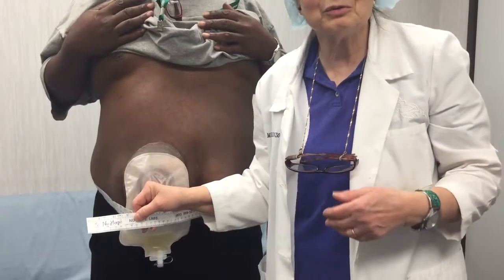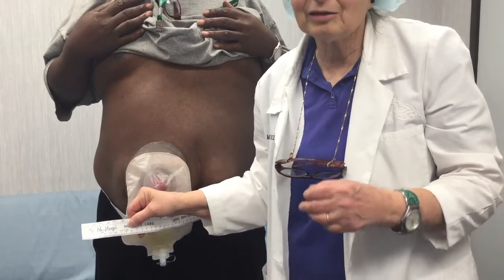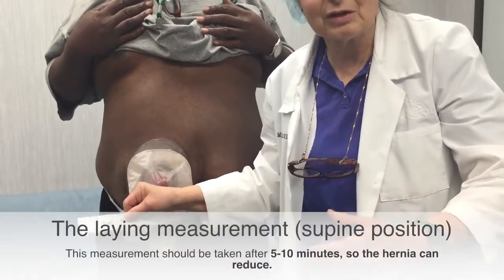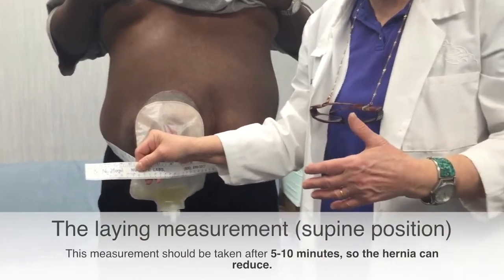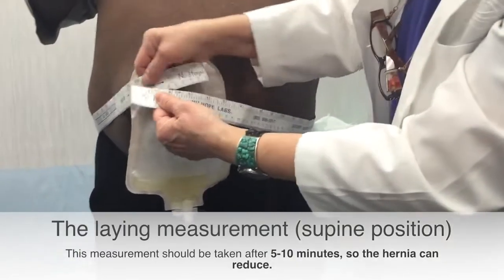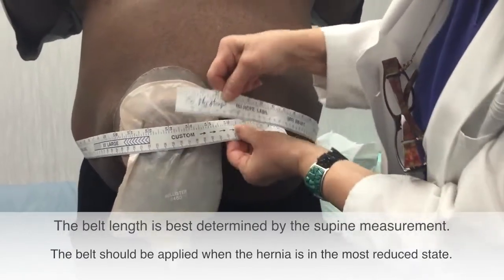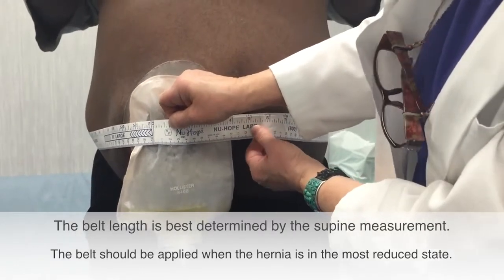So what we're going to do is determine the length of the belt that we need. It's good to do this not only standing, but I'll have him lie down to see if there's a big difference between lying and standing in the girth measurement of the hernia. The first thing we want to do is measure in line with the stoma, and in line we're right at the edge here at 52.